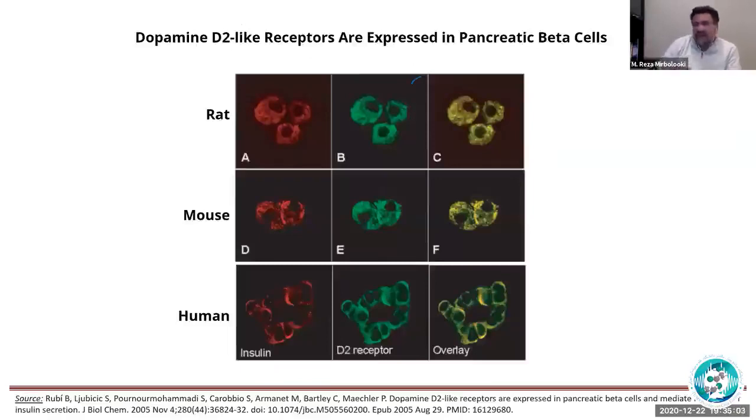So far I just talked about brown adipose tissue. I want to switch to the pancreatic islets. For the brown adipose tissue, the approach we used was functional imaging, based on F18-FDG. We activate the cell or the tissue, and then they start to burn more glucose, so they need to take up more glucose, and we just measure that uptake, which is the approach whenever you use F18-FDG in any place.